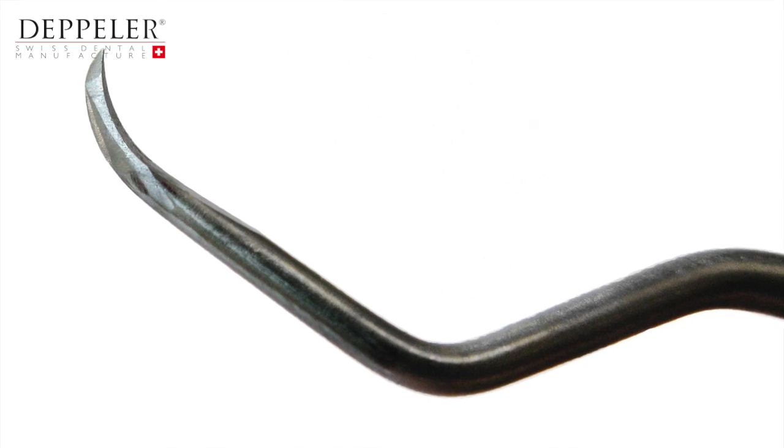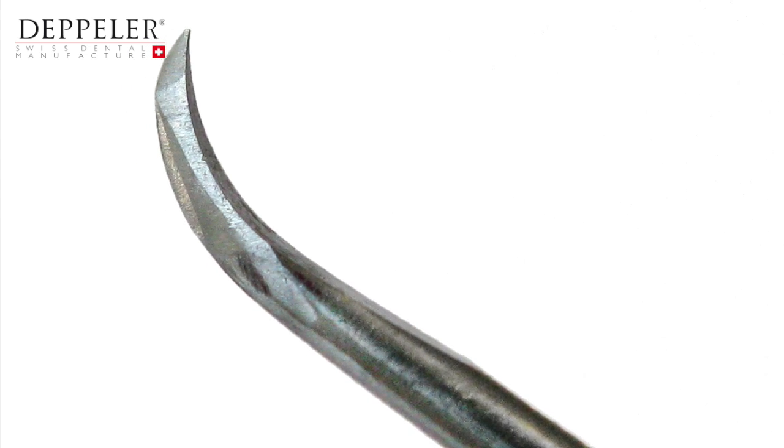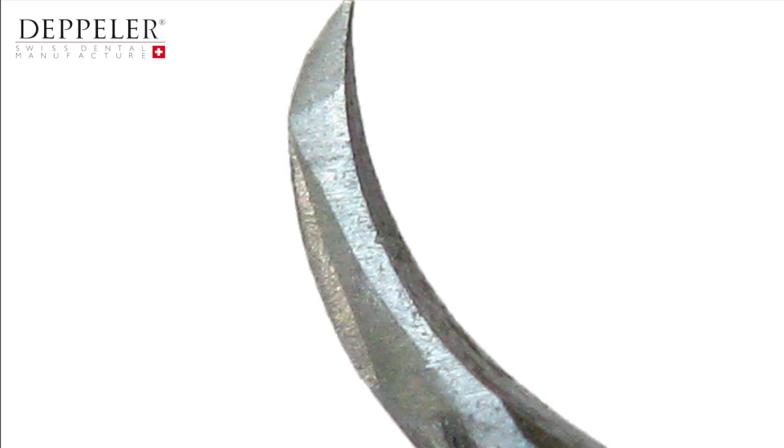Here is an example of poor sharpening. The instrument has multiple facets and the blade's cutting edge is serrated. The blade will appear to be extremely sharp, but the microteeth quickly become blunt and the instrument must be sharpened more often.